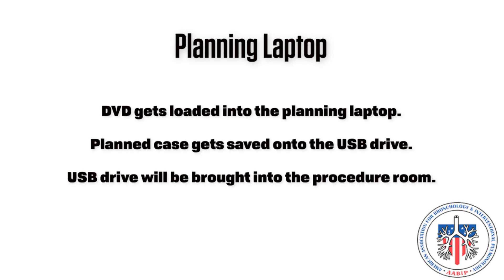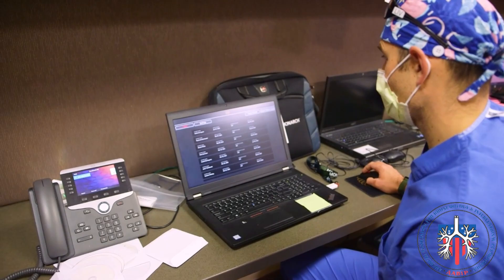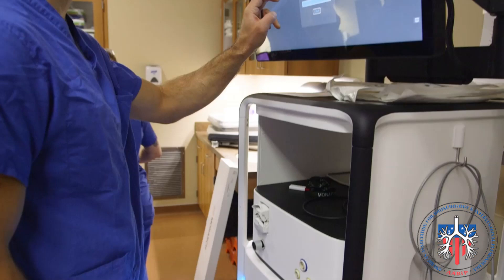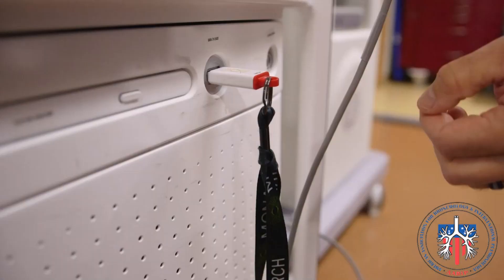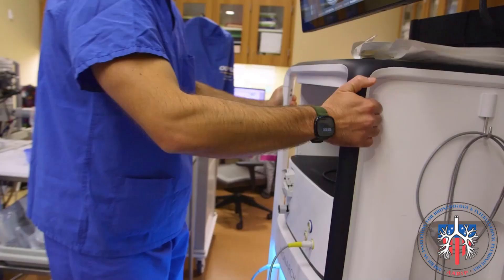Planning laptop. The planning laptop has a DVD drive and a USB port. The DVD containing the patient's CT scan is loaded and the exported plan is loaded onto the USB drive. This will be inserted into the Monarch robot tower to upload the current plan for use. Best practice is to remove the USB drive immediately after upload to avoid damage to the USB port from contact from the bed.